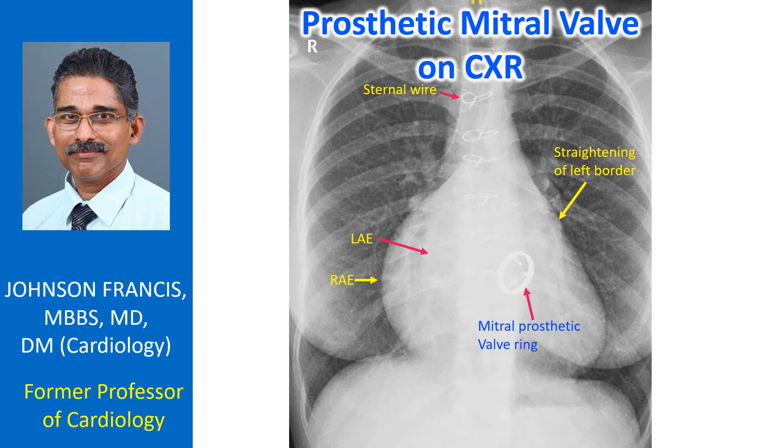There could also be tricuspid regurgitation to account for significant right atrial enlargement. As the tracheal air column is seen well, the indentation on the left side by a left-sided aortic arch is clearly seen.